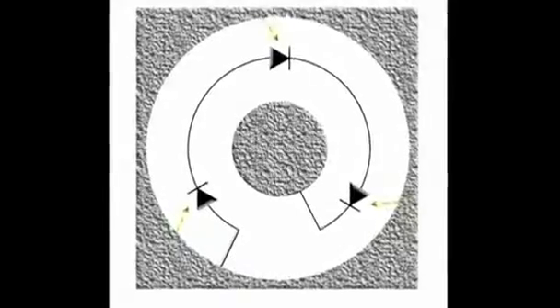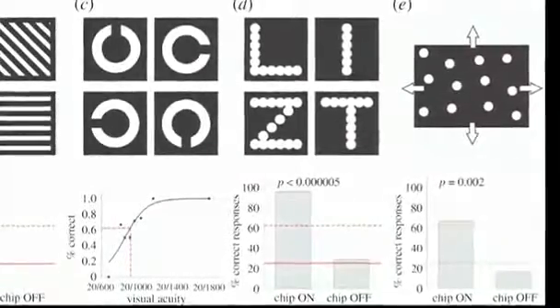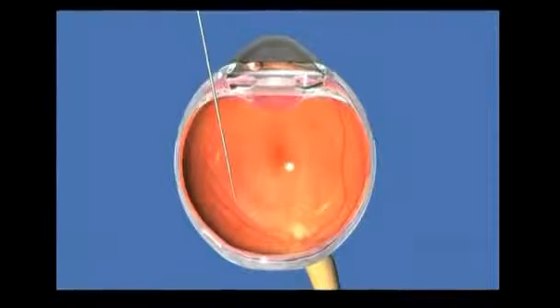If you project a checkerboard on a rat's eye, and then move that around, if the rat perceives that as a checkerboard, then that tells you that he has that kind of resolution. If that's below his perceptual resolution, it'll just look gray to the rat and you'll see no brain waves. So by taking these checkerboards of different sizes and reading the brain waves, you can actually tell the resolution of what the rat's seeing. The team is now in the process of gauging just how well their retinal prosthesis works.